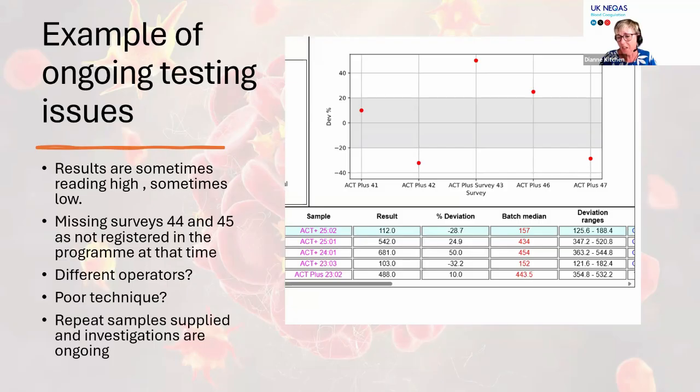The next survey is currently live. I've just had a look. They have not entered any results yet, and it finishes on Friday. So I'm hoping, fingers crossed, that they will get round to doing some testing, because of course if you don't do the testing, you can't check the devices.